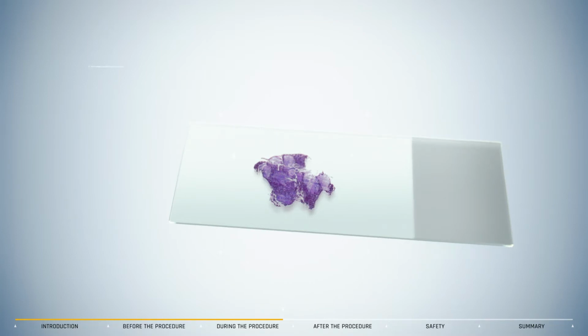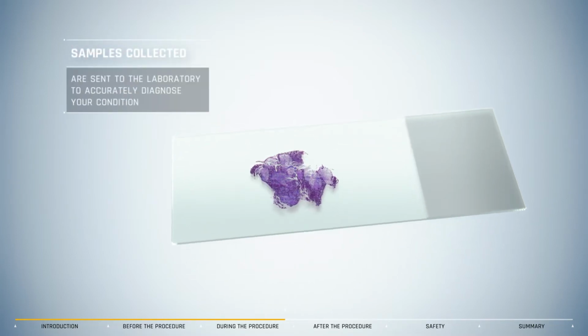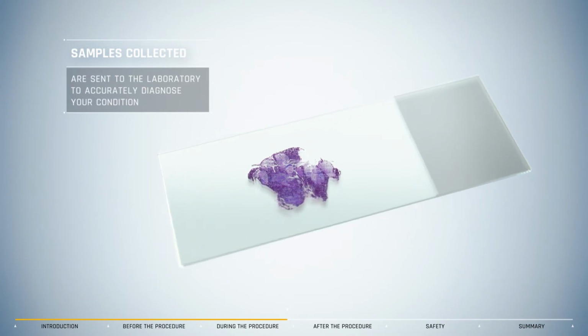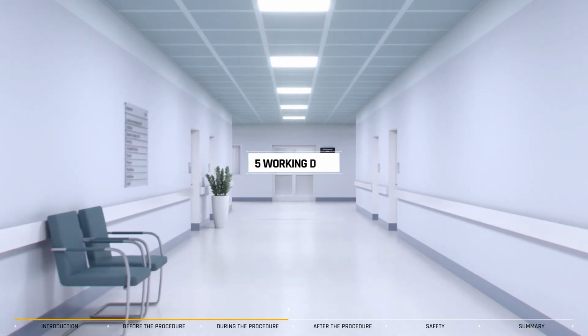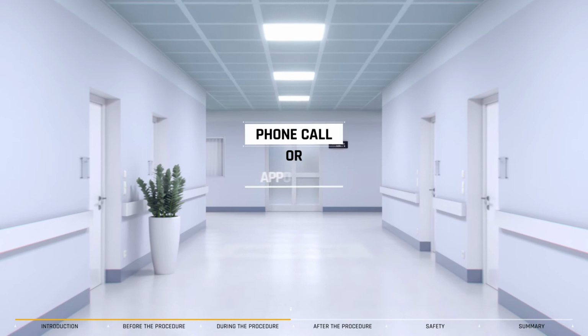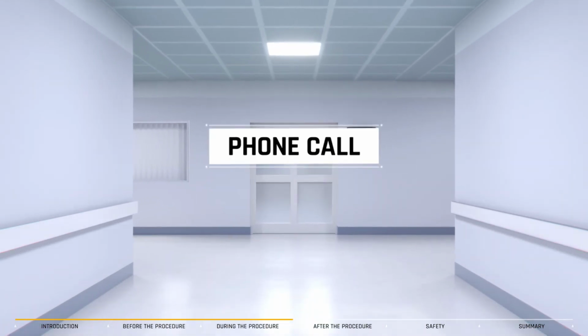The samples collected during the EBUS procedure contain cells, which are then analysed in the laboratory to accurately diagnose your condition or illness. This generally takes at least 5 working days, at which point your physician will call you or have you come into the hospital to discuss the results and the next steps in your care.